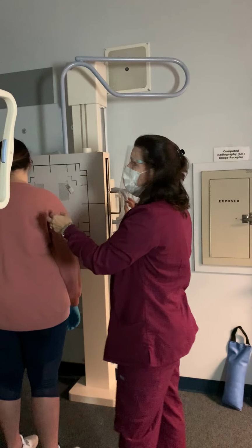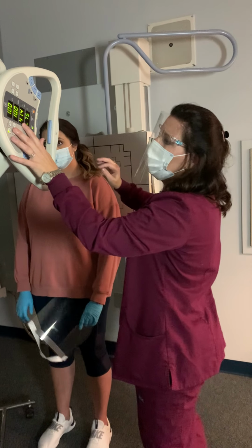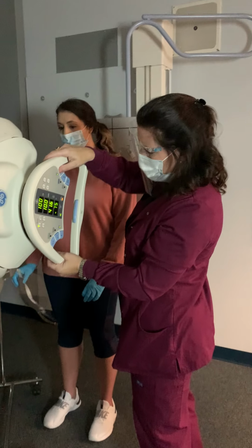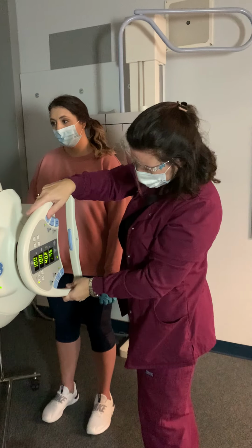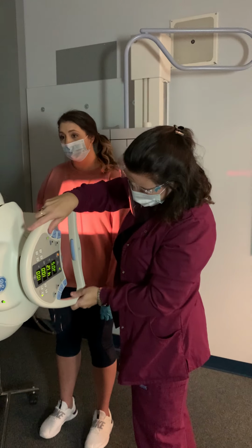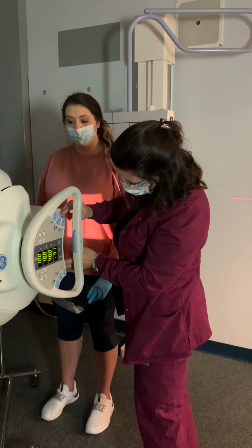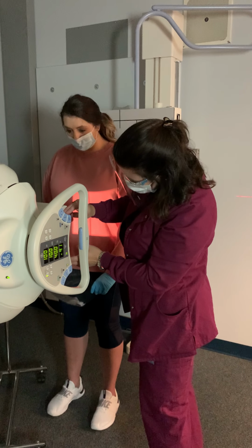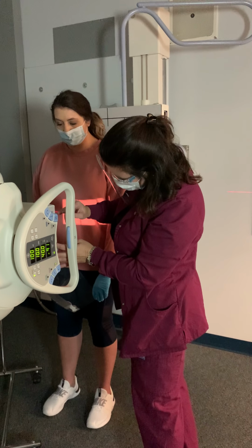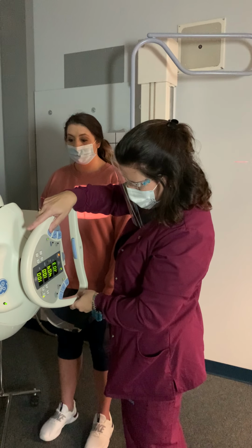Let me flip you back around. I'm not at 41. Gotcha, okay. Let's go back. Let me see, did it stay this way? It might be my 72 inch angle. 12. 8. And then we're going to go up to 105.